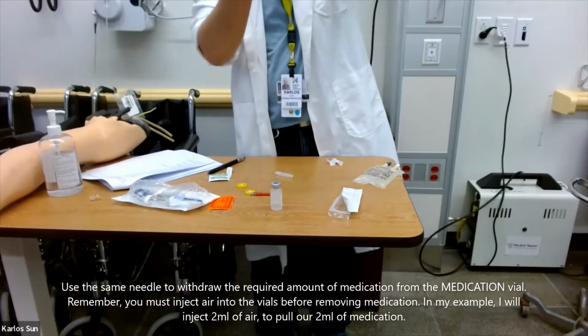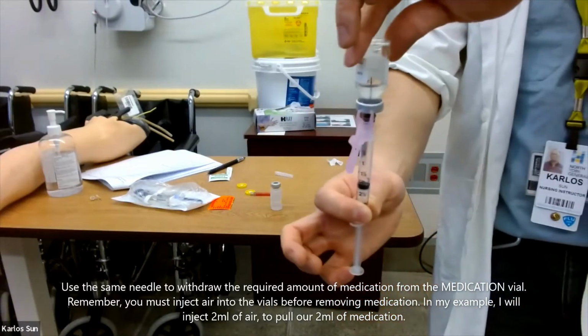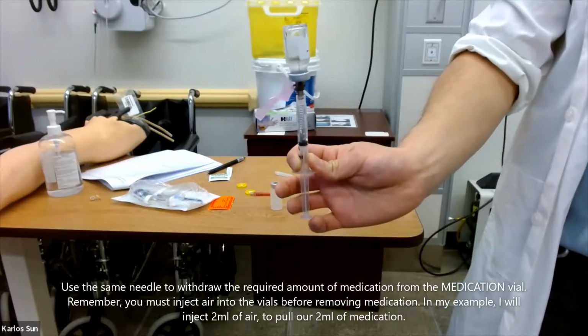In our example, I will inject 2 milliliters of air so I can pull out our 2 milliliters of medication, which is equivalent to 100 milligrams as ordered by the doctor.